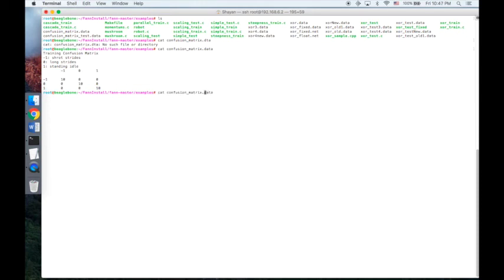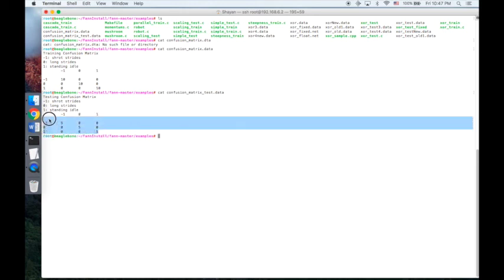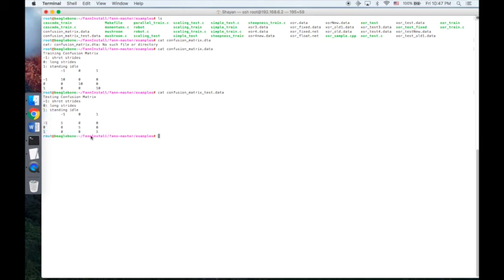Also, as testing of the system was completely successful in each trial, this is the confusion matrix for the testing, and here we have a perfect confusion matrix. We tested 5 trials of motion for each type of motion, and as you can see here, both of the confusion matrices don't have any off-diagonal non-zero elements, as they're perfect, as the training in the system was successful in every single case.